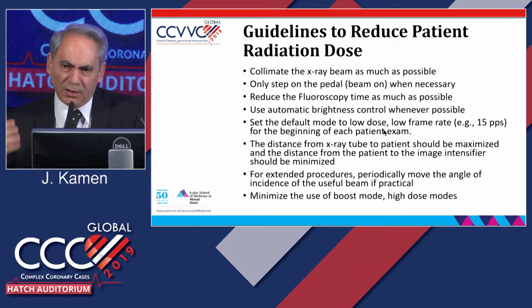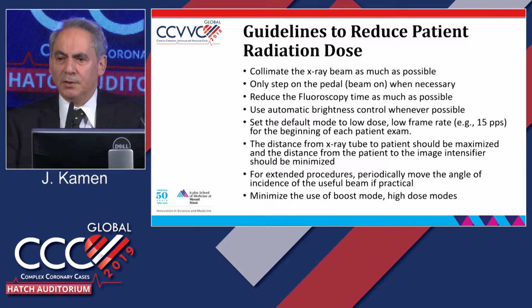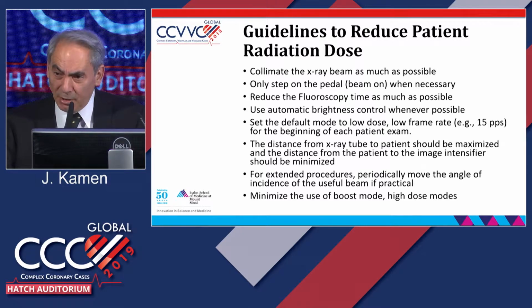So these are the techniques that I strongly suggest you practice when you are alone, and reduce, because Joint Commission and all the other types of regulatory agencies that I know are going to go after you, because it's a lawsuit and they have to protect people. You are in the business of saving lives, but sometimes there are complications. So you have to watch how much fluoro you give to the patient.